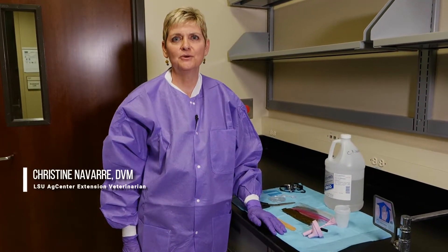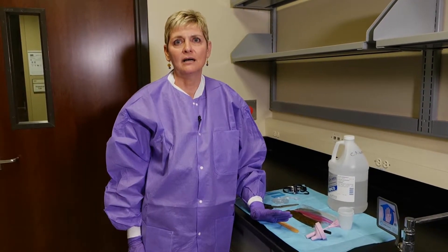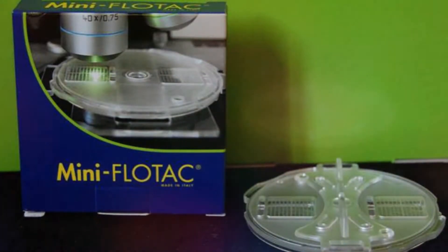Hi, I'm Christine Navarre with the LSU AgCenter. I'm the extension veterinarian and today we're going to talk about the mini flowtack. This is a very easy and inexpensive method to get quantitative fecal egg counts on ruminants.